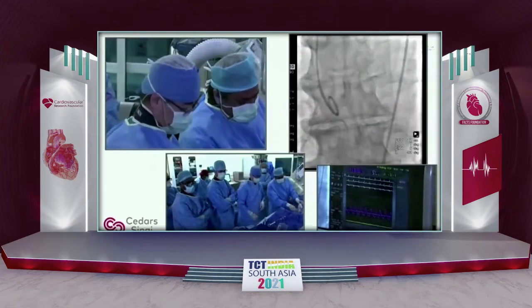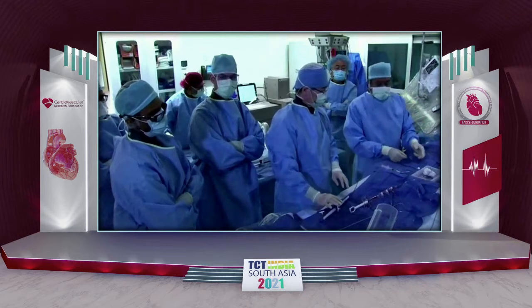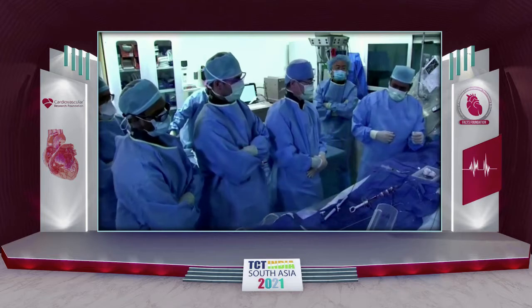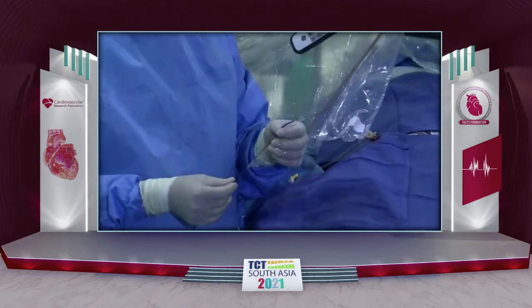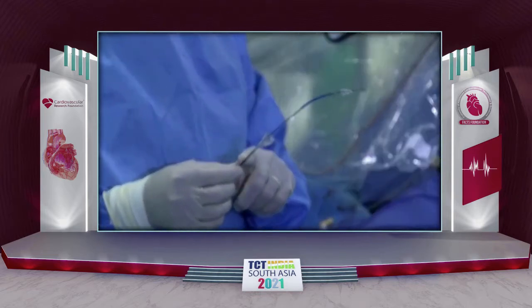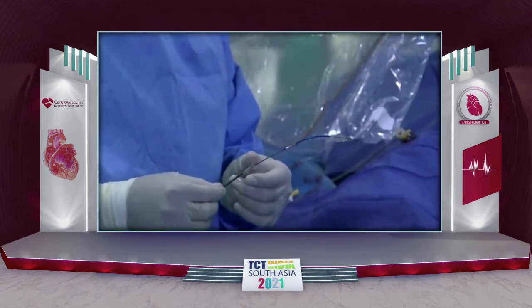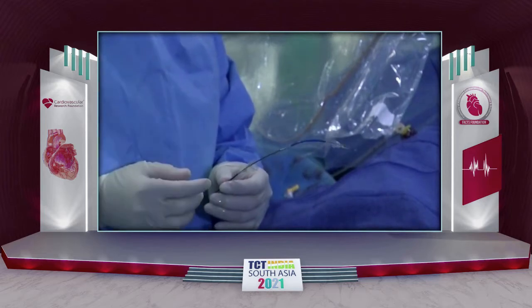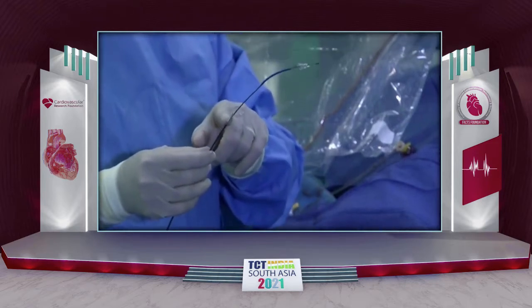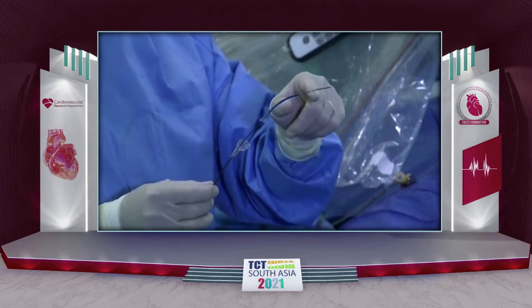This morning, we randomized this patient. We had a neurologist assess this patient at 5 o'clock in the morning. And it so happened that he randomized to the Sentinel device. For those in the audience who are not familiar with this device, we are currently enrolling patients in the PROTECTED TAVR study. It's a large study, 3,000 patients, to test whether using this device is going to reduce stroke. This is the proximal filter, which is stationed in the brachiocephalic, and this is the distal filter, which will go into the carotid artery.